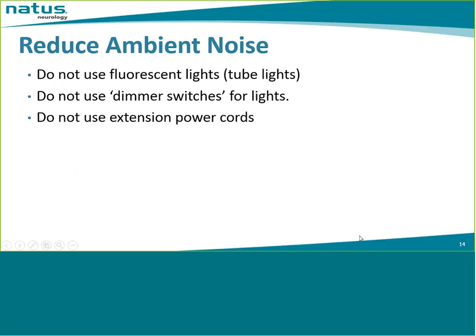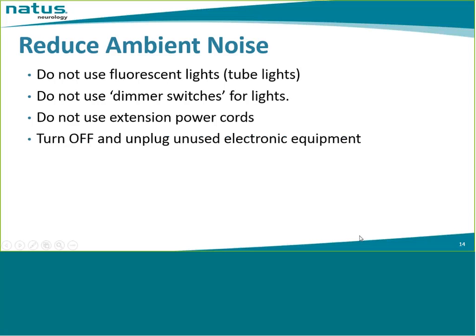Do not use extension power cords. The power cord is essentially an antenna, and when the electricity passes through it, it gives out electromagnetic radiation. So the smaller the power cord, the less will be the electromagnetic radiation. So avoid extension power cords.